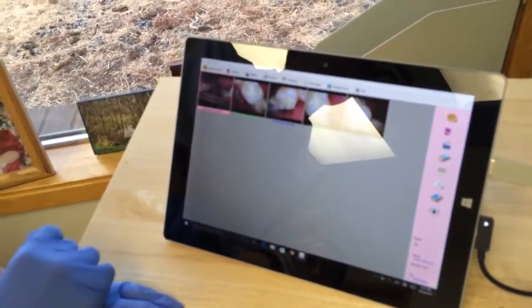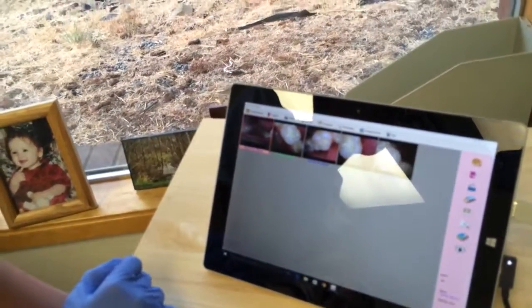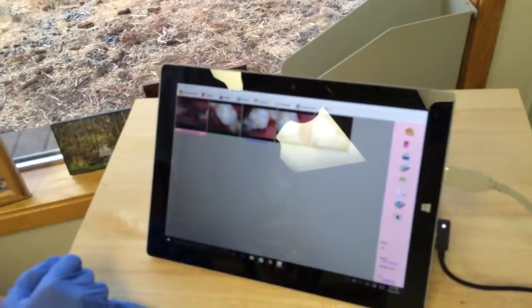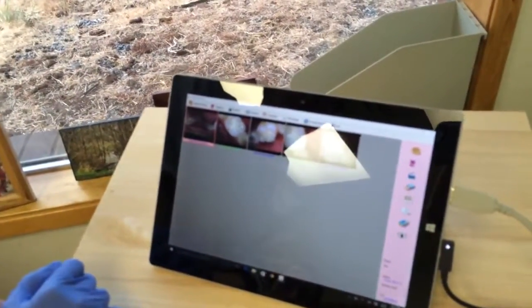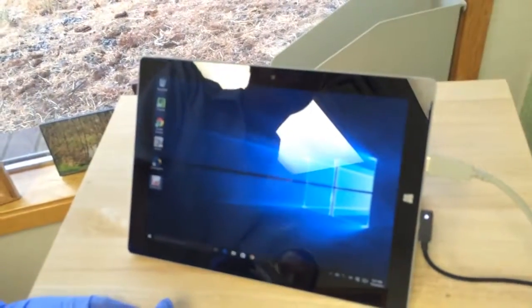Anything else that you guys want to cover on the video? Can't think of anything. All right. If it fails, let us know. So, make it reliable. Sounds good? Yeah, I think it looks pretty good. The images are good. Powered down right here. It's that simple.